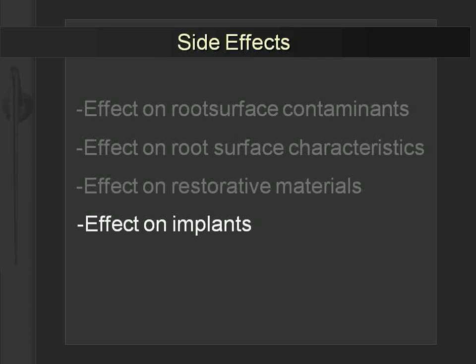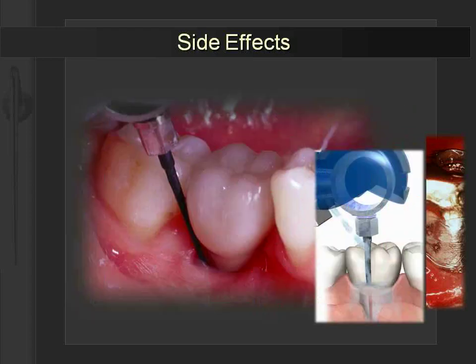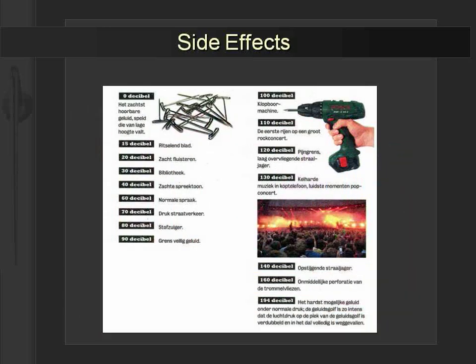Then if you instrument implants, if you have these titanium surfaces, you'll have scratches, and this will induce extra adherence of plaque and calculus. Some instruments have these nice carbon fiber tips. This one I particularly like. It's like a probe, and you can stick it in between the gingiva and the implant restoration. I usually find it very difficult to instrument at all between an implant restoration and the gingiva, so this is a nice one to use. This one is in Dutch, because I don't have it in English, so this is for you to learn some Dutch.